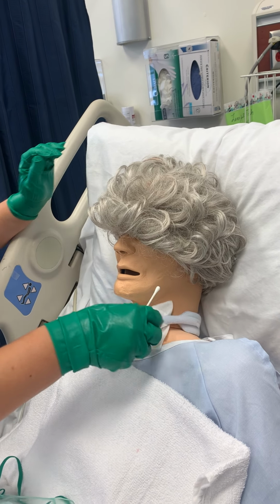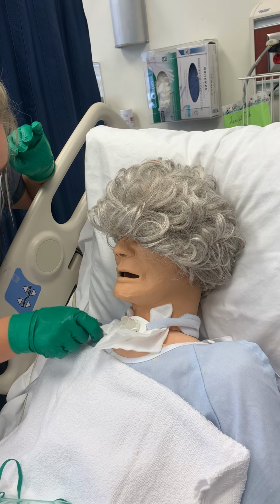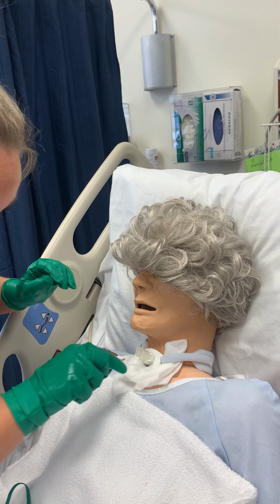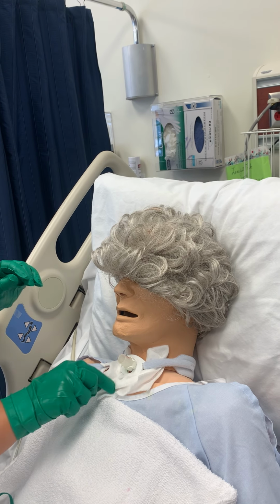Okay. Okay, so now that it's at least around the trach, I can work to maneuver it.